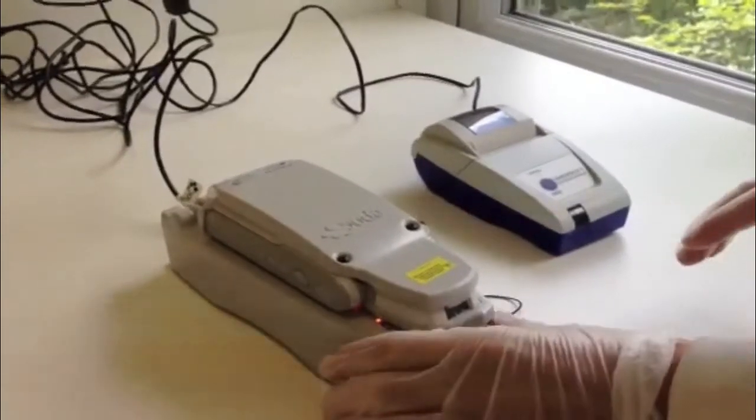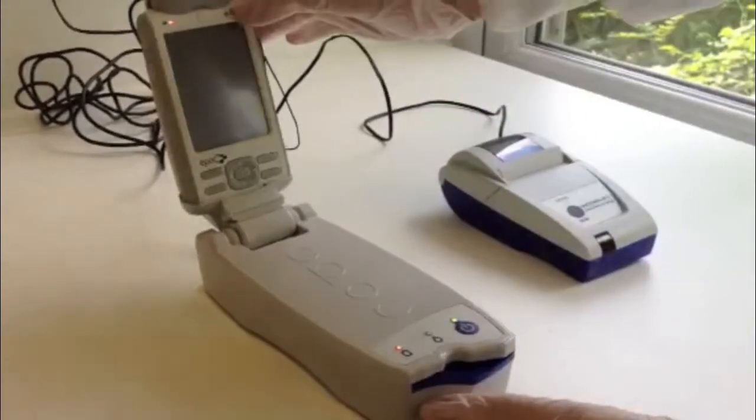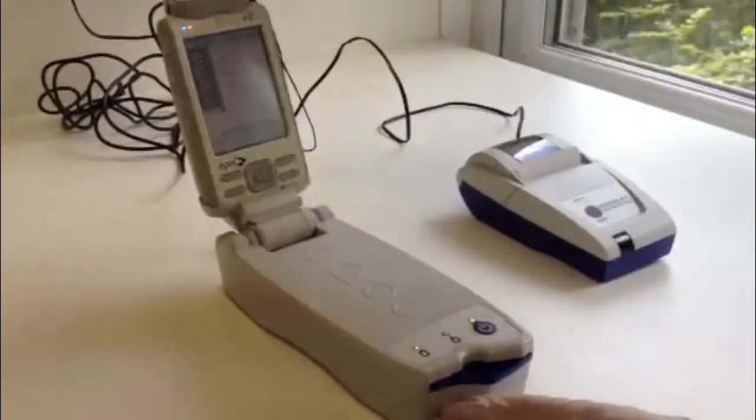The EPOC analyser consists of a host and reader that link to each other using a Bluetooth connection. Firstly, you need to lift up the host and switch both units on.